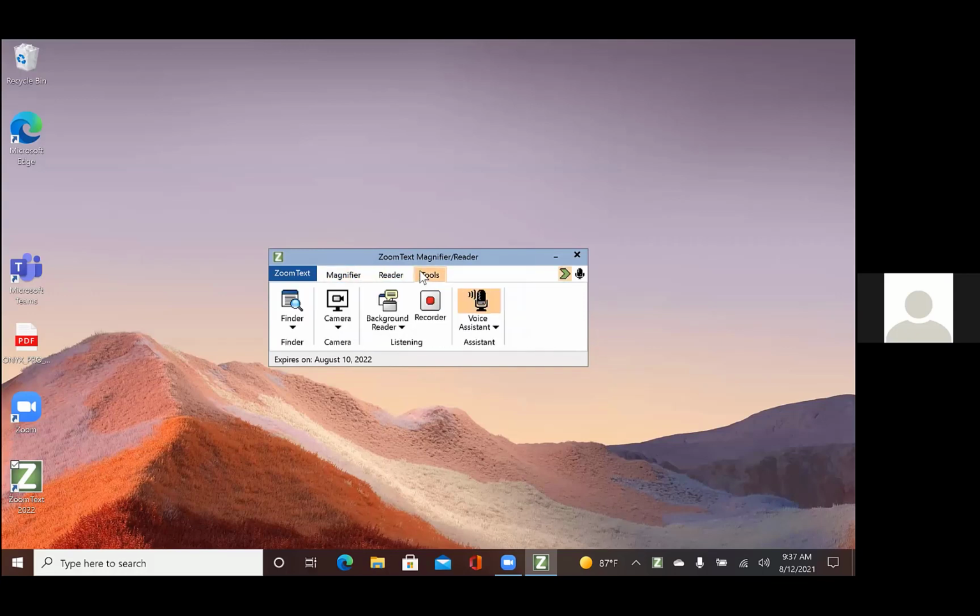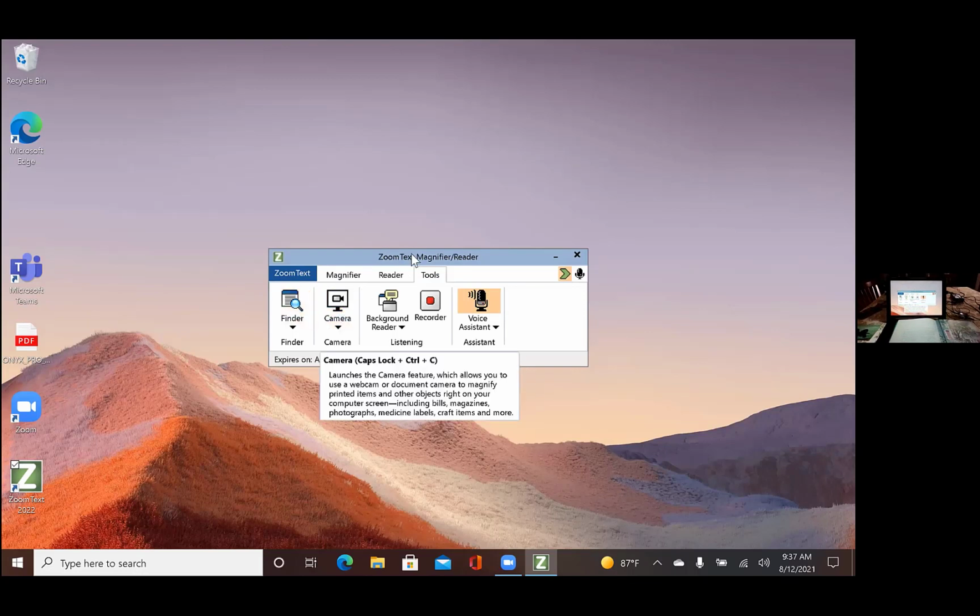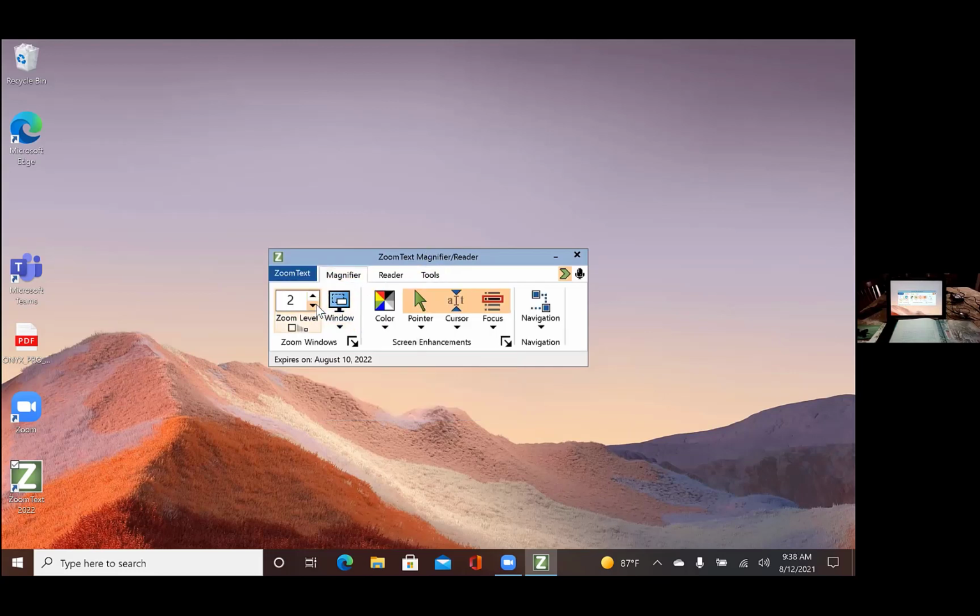What we might want to do is spotlight my video here for a second, and see what I see here. Awesome, thank you. So you'll see there, you've got the image. Does that show through okay there for you? And you can see it. Awesome, thanks, Terry. So inside of ZoomText, you'll notice we do have some magnification going on here. So there's your magnification. And over in Tools, you have an option for camera.